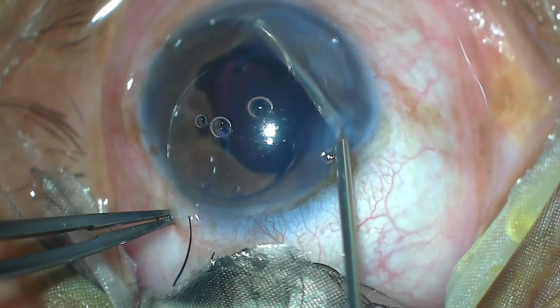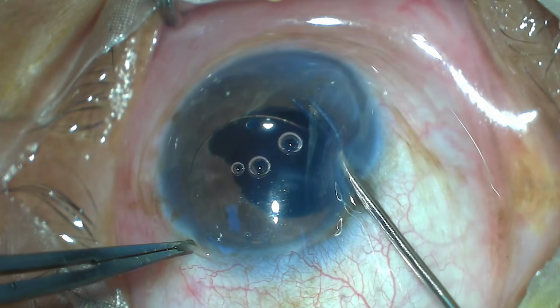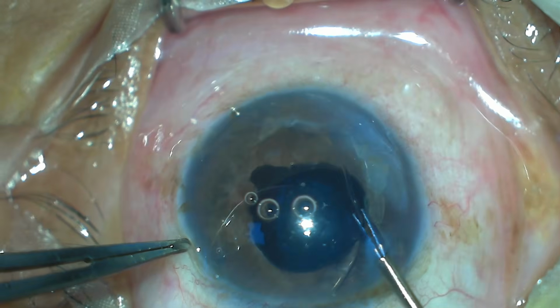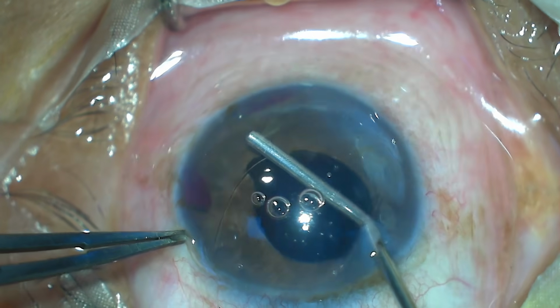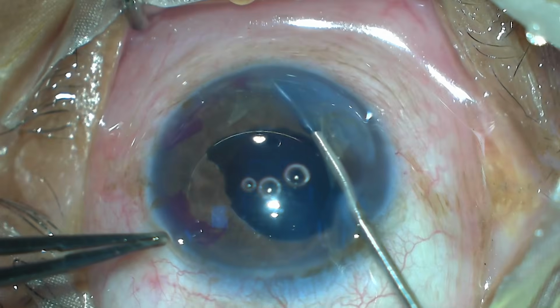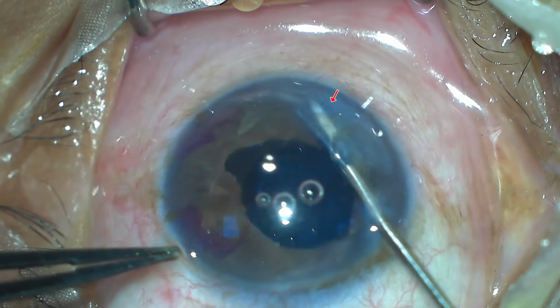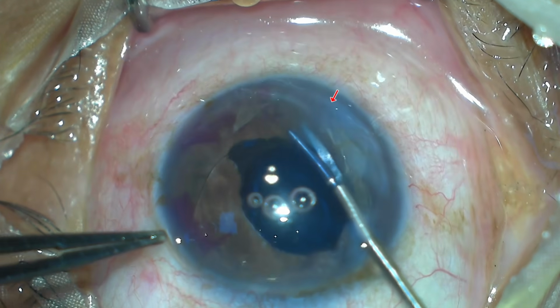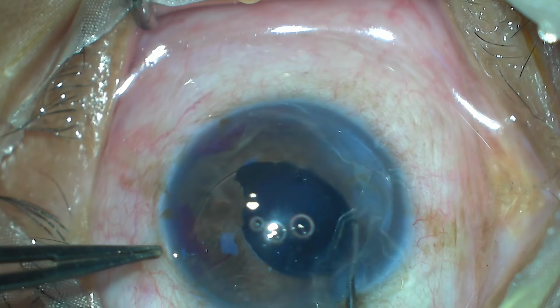After injecting a little viscoelastic, pulling out the haptic from the entanglement with a microforceps could not help. Rather, a great traction caused an iridodialysis along with fresh hemorrhage from the angle. Next, I tried to cut the fibrous tissues wrapped around the haptic to make it free from the iris fibers with micro scissors and tried to gently pull with the dialer again, but it did not work.